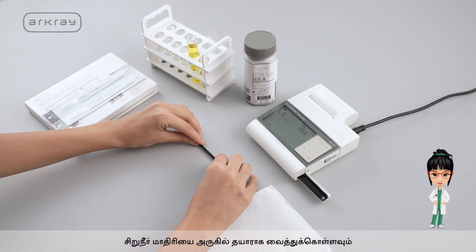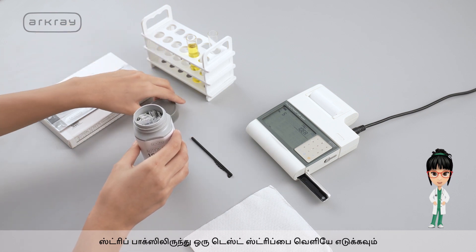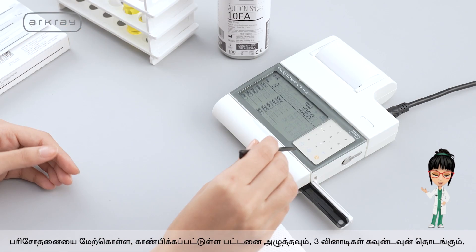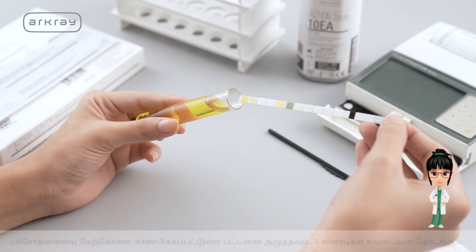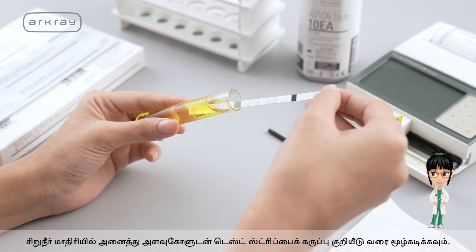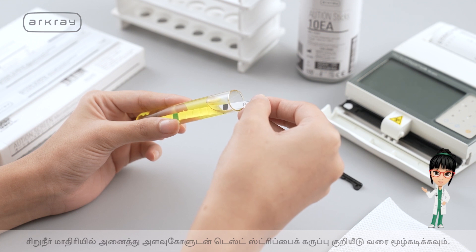Keep the urine sample ready and near. Take out a test strip from the strip box. To run the test, press the button shown and the 3-second countdown will start. Dip the test strip with all the parameters in the urine sample, right up to the black mark.